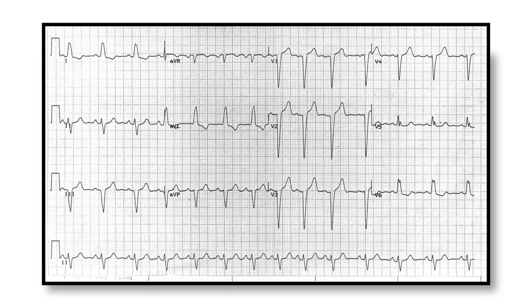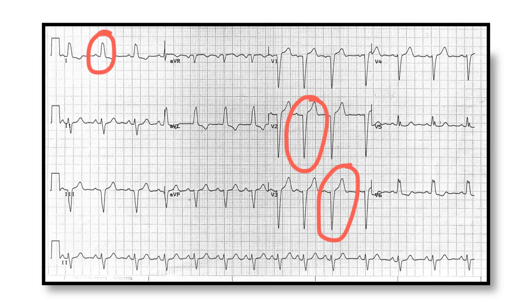We can see that very clearly if we look at the 12-lead ECG. In leads where the QRS complexes are negative, we can see that the ST segments tend to be elevated. Conversely, in leads where the QRS complex is positive, the ST segment tends to be depressed in those leads. This is appropriate discordance.